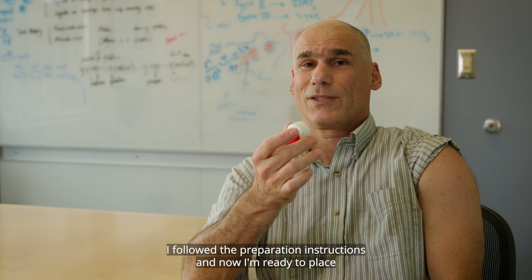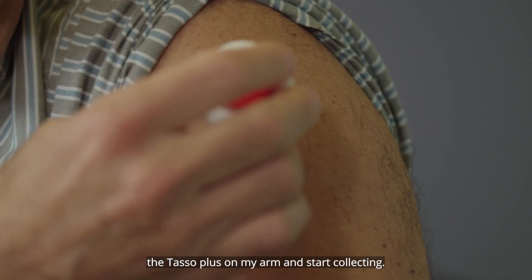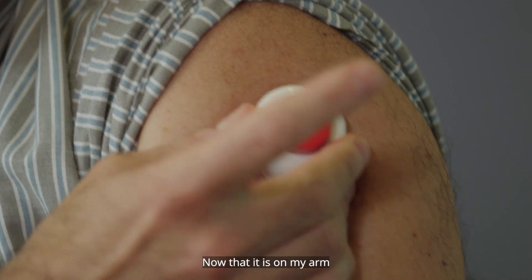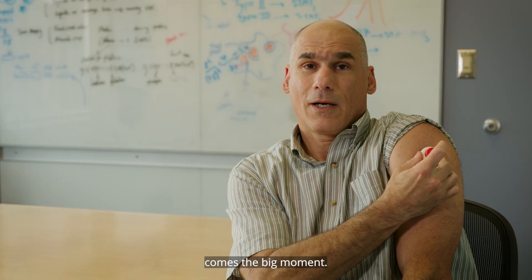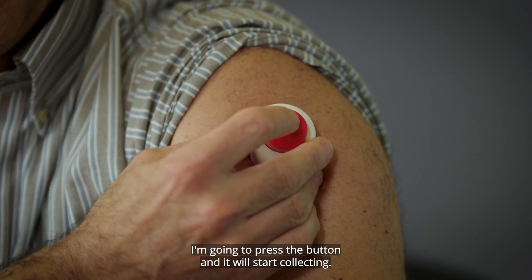I followed the preparation instructions and now I'm ready to place the Tasso Plus on my arm and start collecting. Now that it is on my arm, comes the big moment — I'm going to press the button and it will start collecting.